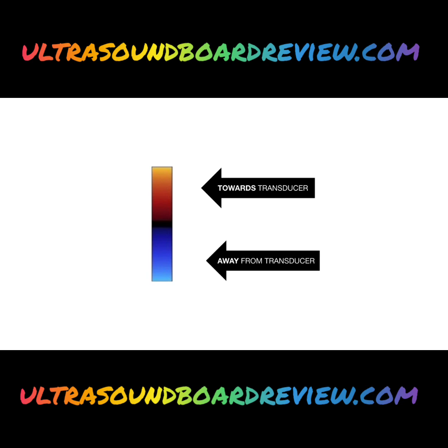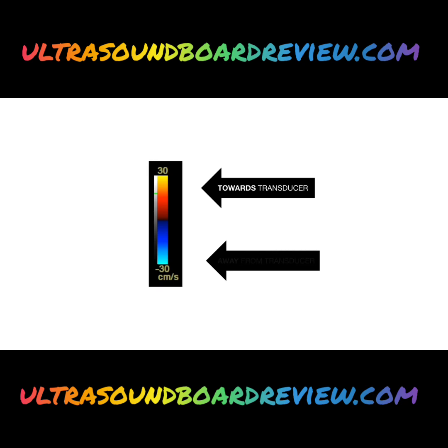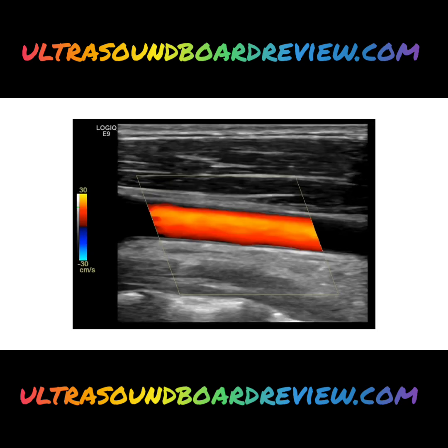It could be red over blue, or blue over red, or pink over green, or pizza over kittens. It does not matter. Top is always towards, and bottom is always away. Now back to the color map from our image. So from our image, we had red on top, which means the color on top is going towards, which means red is going towards our transducer, and we have blue on the bottom, which means whatever on our image is blue is flowing away from the transducer.